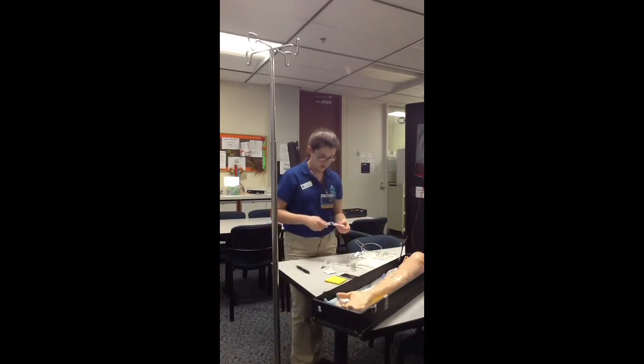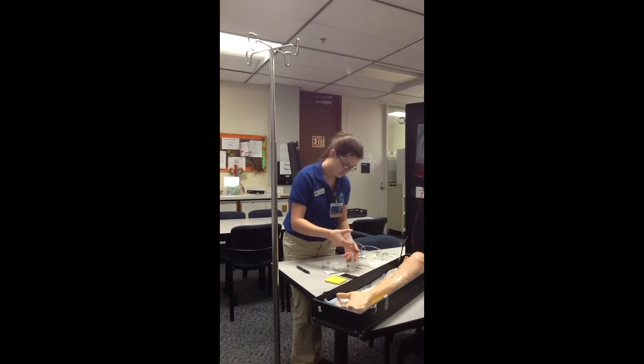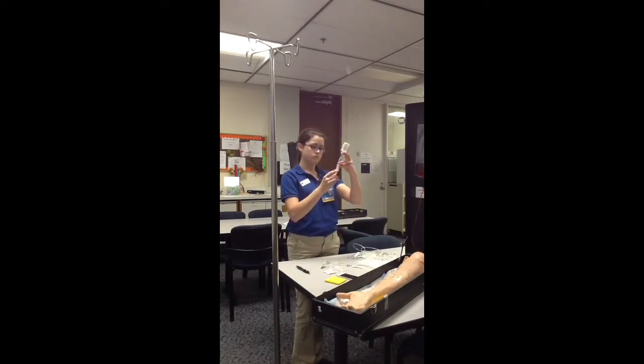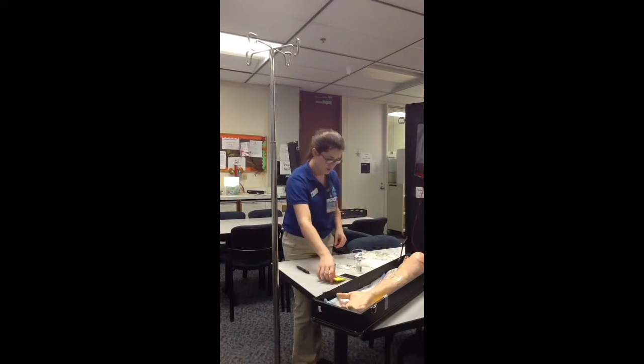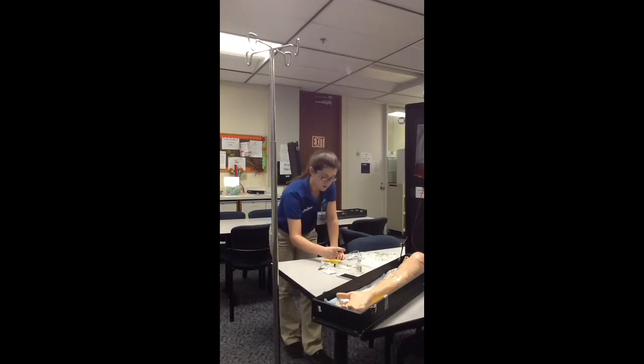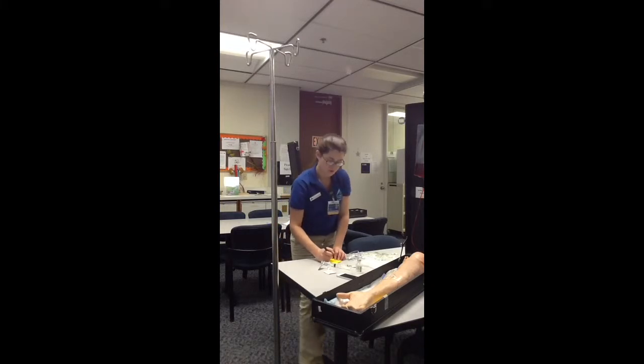Now I'm going to draw up 6 milliliters of normal saline solution. And before I go into my patient's room, I'm going to label the bag with the client's name, the drug, the dosage, the time, and my initials.